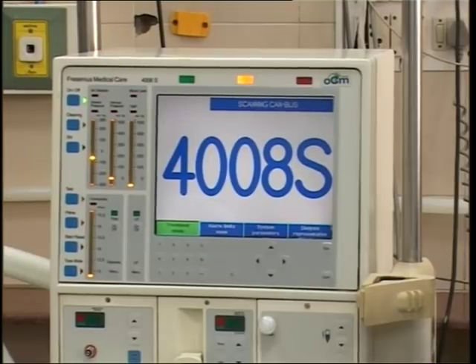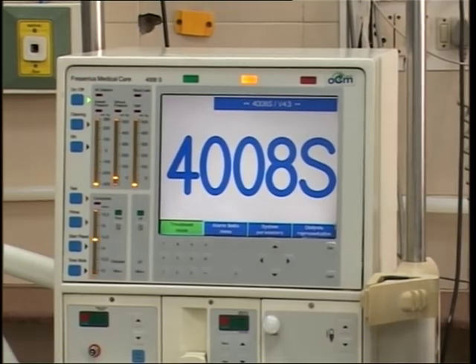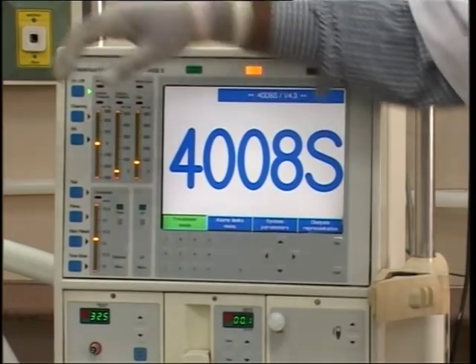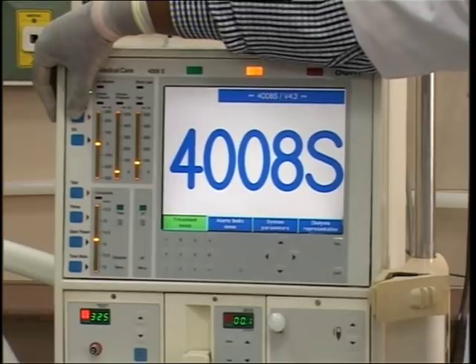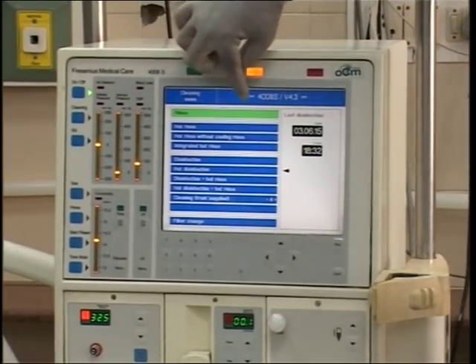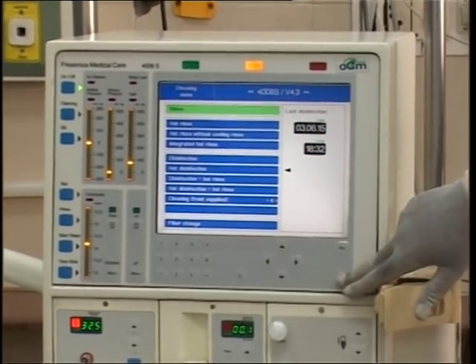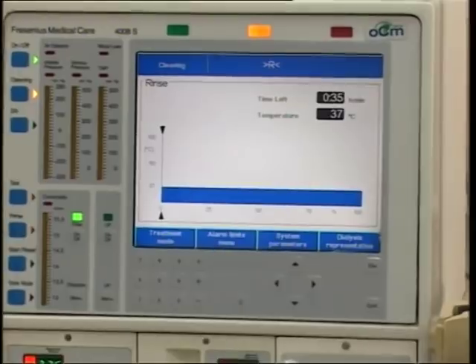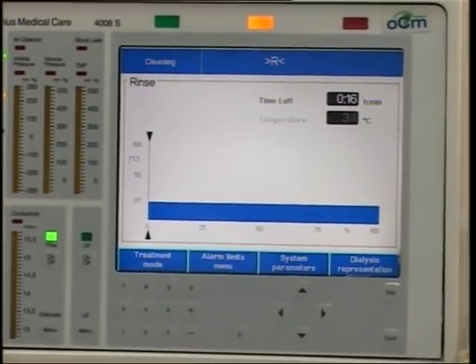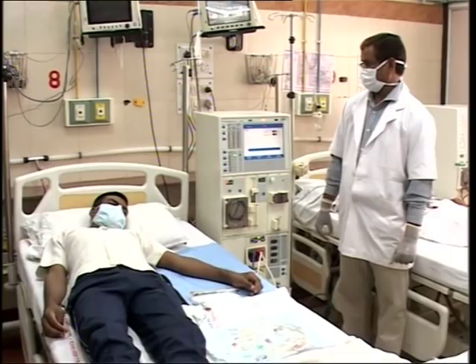Once the machine is switched on, press the cleaning button located below the on/off switch to select the rinse mode. The machine automatically goes into the rinse mode. This process is called the cold rinse, and it usually takes 16 minutes to complete.